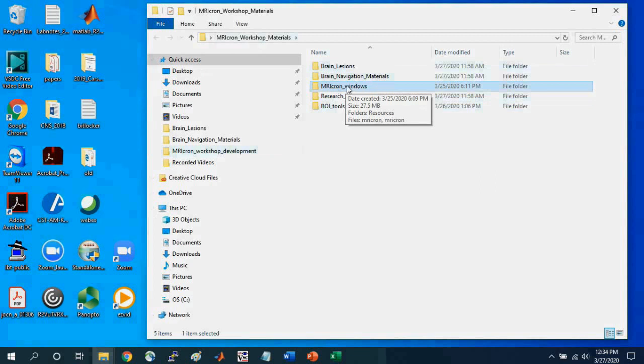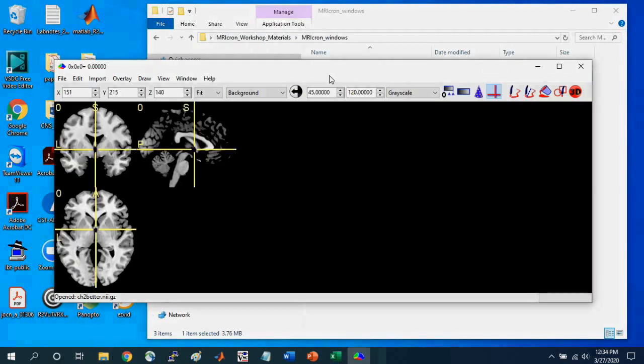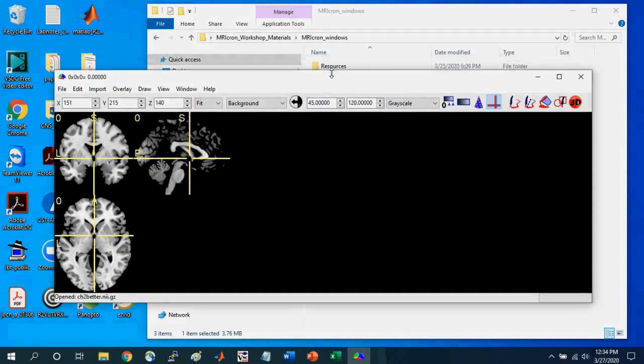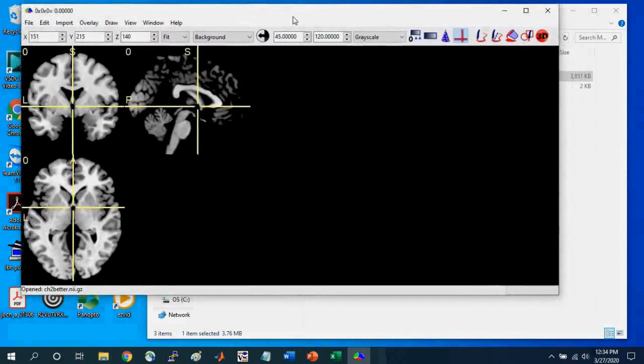And so you can access the files in these folders for certain materials. Okay, so first I'm going to open MRI-Cron, and just go into the folder and select the icon.